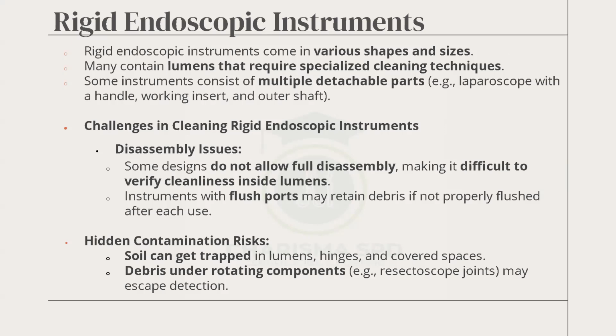Rigid endoscopes, endoscopic instruments come in various shapes and sizes. Many contain lumens and require specialized cleaning techniques. Some instruments consist of multiple detachable parts. Laparoscopic handles, blah, blah, blah. All right, I don't want to read all of that. That's why I say blah, blah, blah.